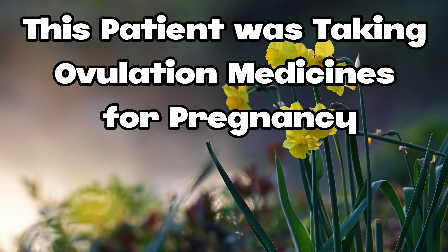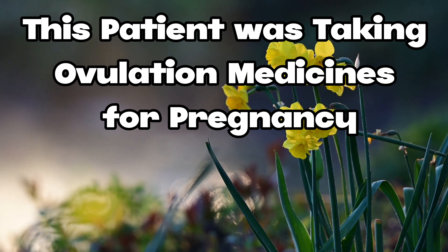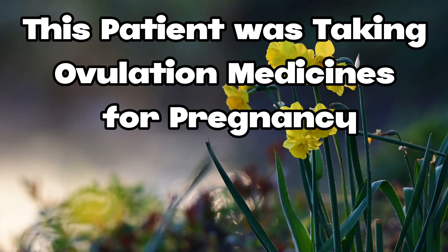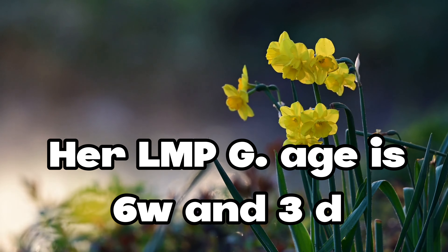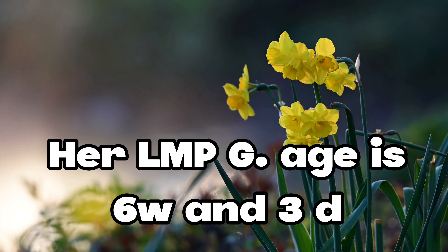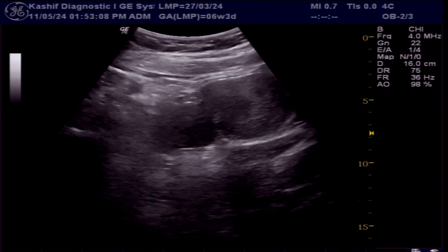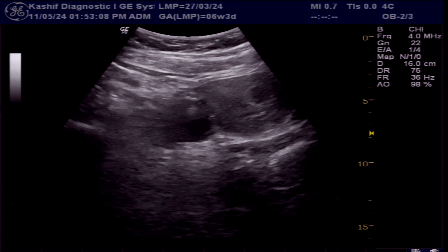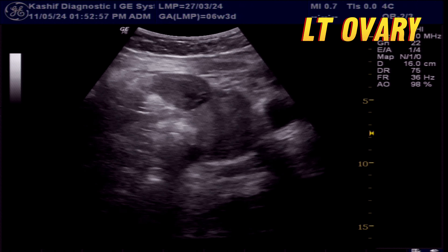This patient is taking medicines for ovulation. This is an early pregnancy; according to LMP, this is 6 weeks and 3 days. This is an abdominal ultrasound. The corpus luteum is seen in both ovaries. The abdominal ultrasound also shows 2 gestation sacs in the uterus.